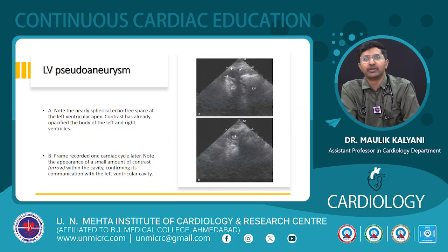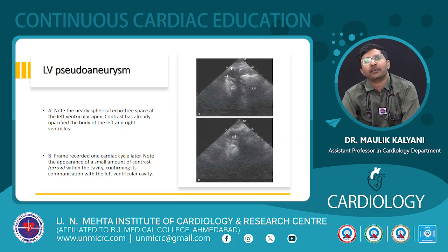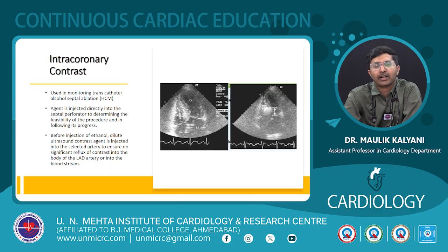The same applies to pseudoaneurysm. On the apical side of the left ventricle, there is an outpouching seen, which looks like it is communicating with the left ventricle. We confirmed with a contrast study, and after some cycles contrast appeared in that pseudoaneurysm cavity also. So it was confirmed that the cavity was communicating with the left ventricle and was part of the left ventricle.